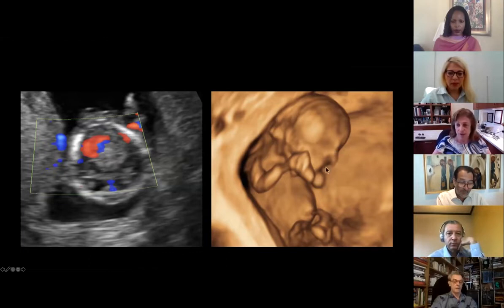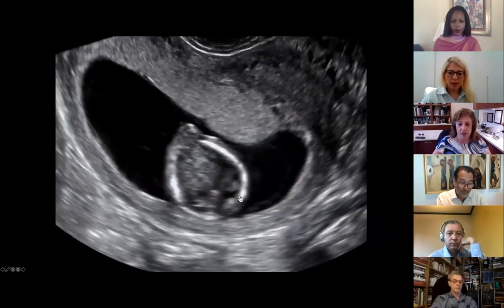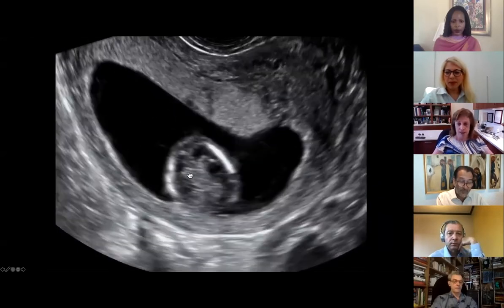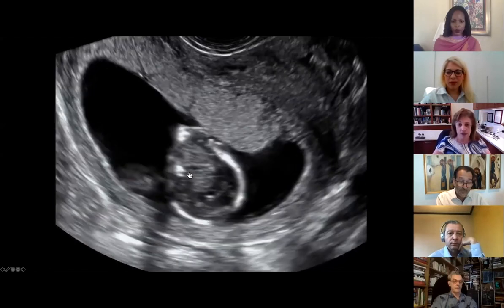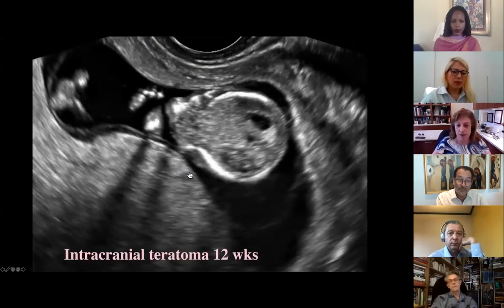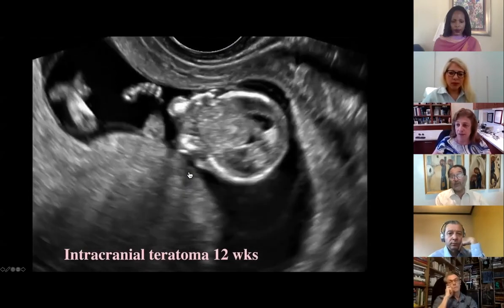Really could not see anything from the front here. And you can see the mass right there. This was growing from inside the head to the outside, to the front of the face. And this was an intracranial teratoma at 12 weeks, a very unusual case.